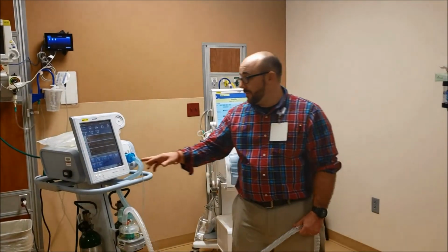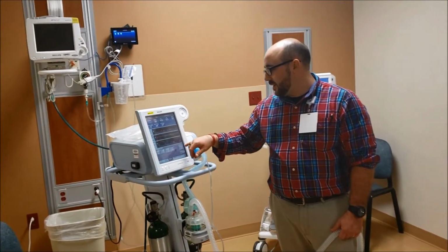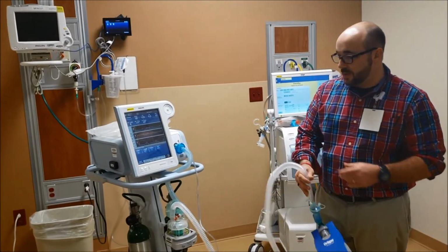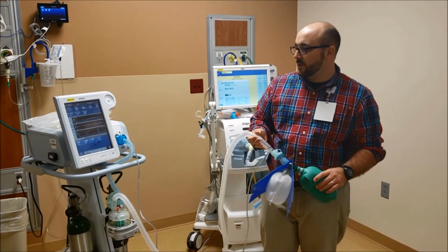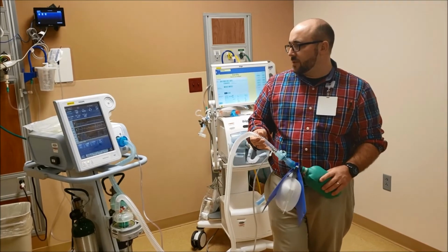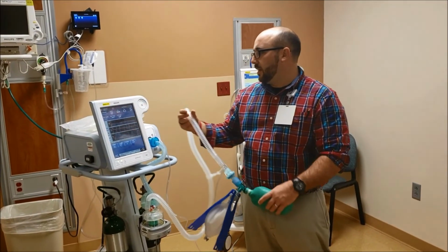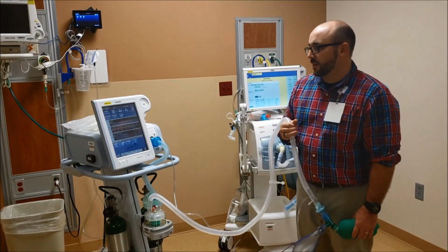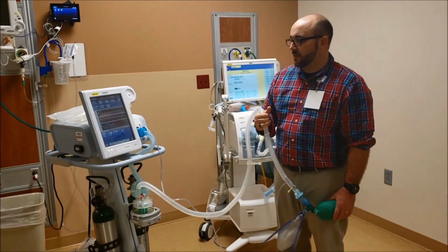Cool, and then CPAP is super easy. Continuous positive airway pressure, activate, that's one pressure going in. You can see they can breathe whenever they want, but they're going to get one continuous pressure. It's going to read a respiratory rate. It does right there, that's a spontaneous respiratory rate. It's a pretty accurate one usually, a lot more accurate than your chest leads. So they're breathing on their own.